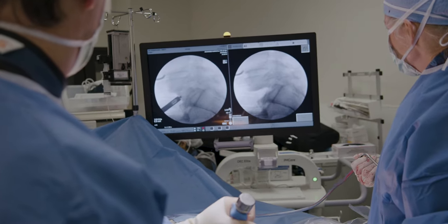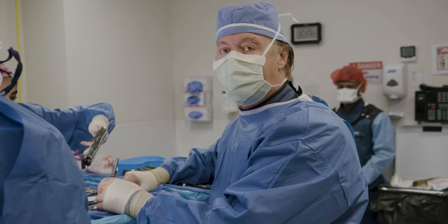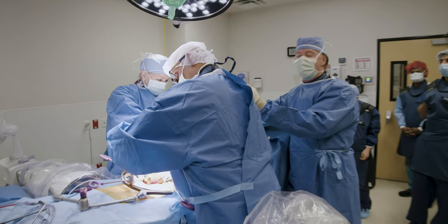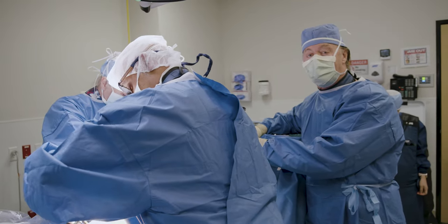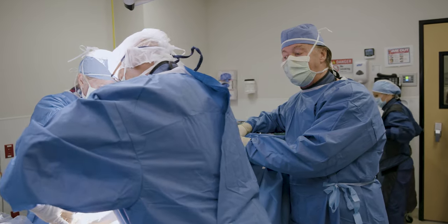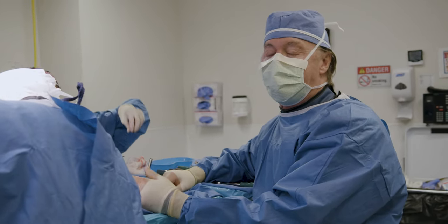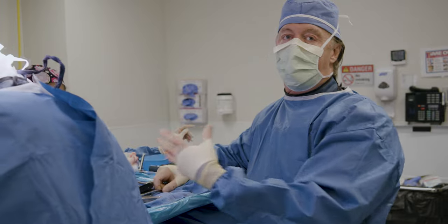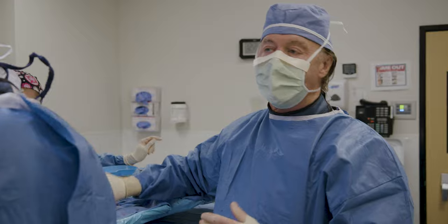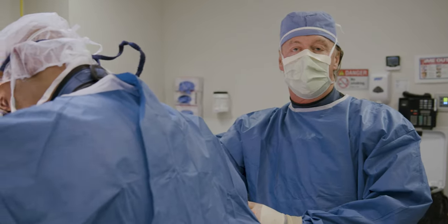Vascular surgery does our exposures because what's in the very front of the spine are the blood vessels. Dr. Raj Rao is one of our premier vascular surgeons who does these exposures — he and his associate have been doing this for 30 years and have done thousands of approaches. They expose the spine and are able to move the aorta, the iliac arteries, the vena cava, and the common iliac veins out of the way, because they sit right in front of the spine. I need those out of the way to fix the discs, so they're instrumental.